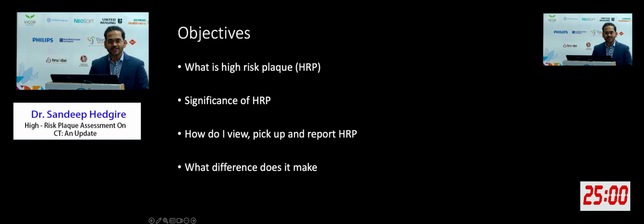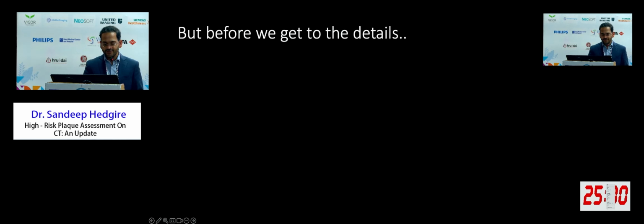Our objective in the next couple of minutes is simply to understand what high-risk plaque is, what the significance of high-risk plaque is, how you review and pick up these findings, how you report them, and what difference it makes to the patient overall if you say there is high-risk plaque on the coronary CT.